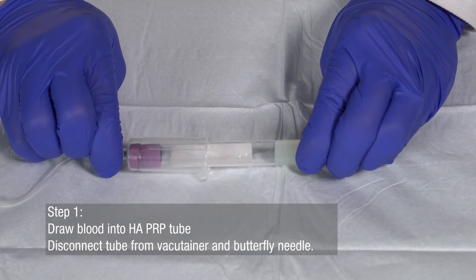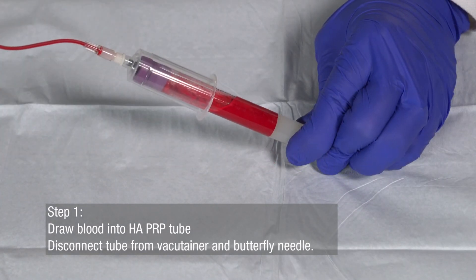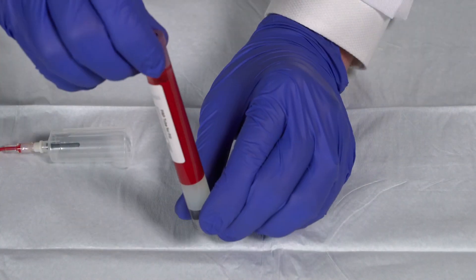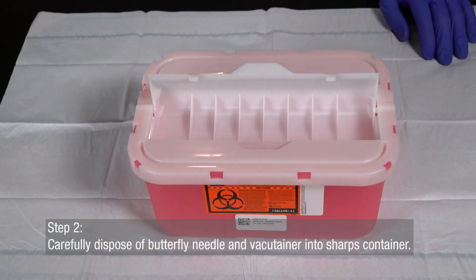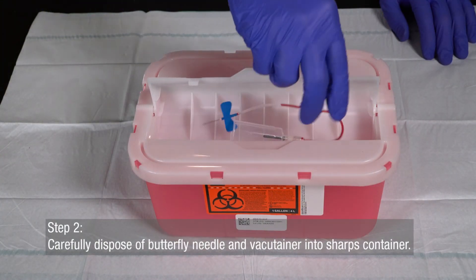Draw a sample of blood into your Juventix Regenerative Medical HAPRP aesthetics tube. Disconnect the tube from the vacutainer and butterfly needle when complete. Note the location of the whole blood sample, the gel separator, and the hyaluronic acid. Carefully dispose of the butterfly needle and vacutainer into a sharps container.